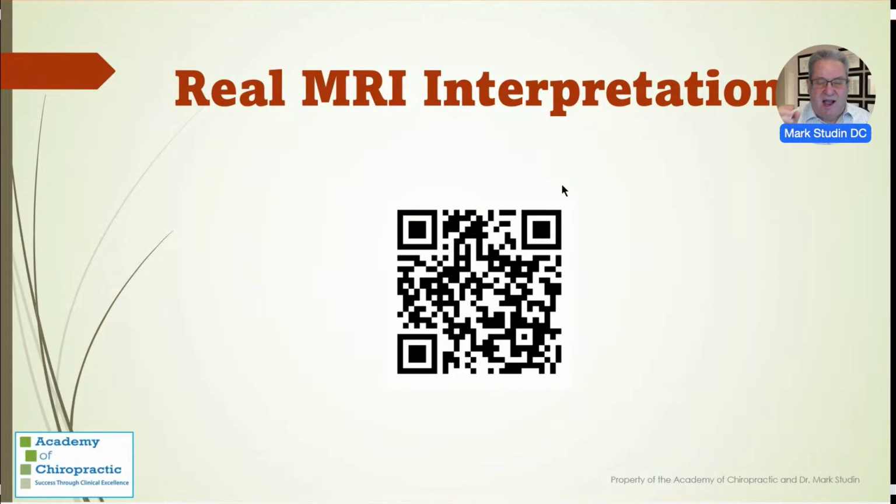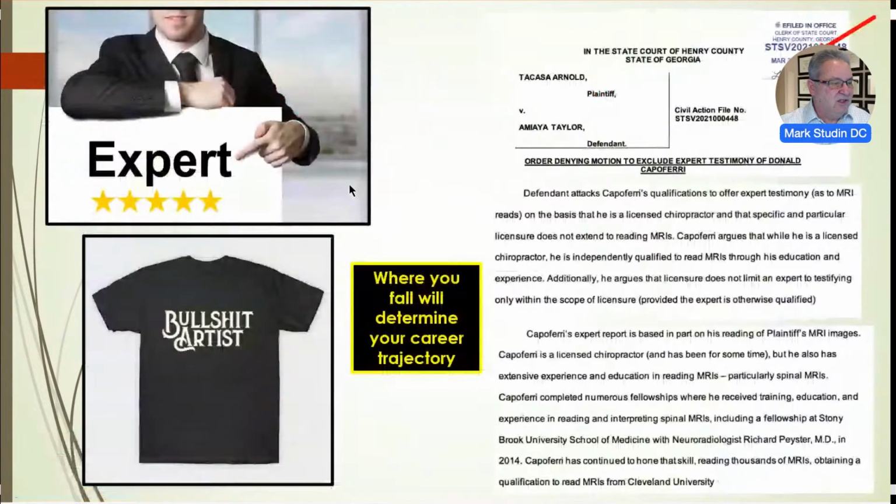Because once I train a doctor, it jumps off the screen at them, or the paper, and they say, oh my God, this isn't right. Something is wrong. I want you to be a real expert, not a BS artist. Most chiropractors historically, and it's changed a lot since when I went to school, and I'm in the game 43 years now, it's changing more through the years, doctors of chiropractic know 5%, but they profess to know 500%. And that's a problem. You've got to be a real expert.